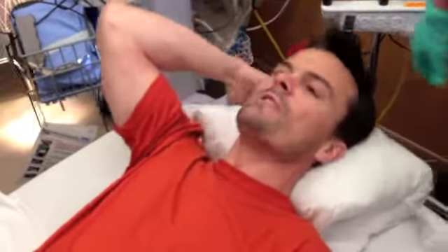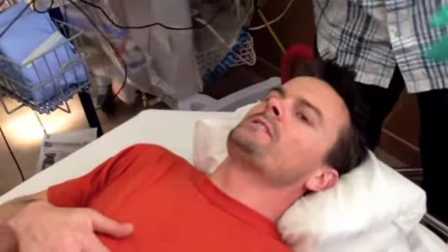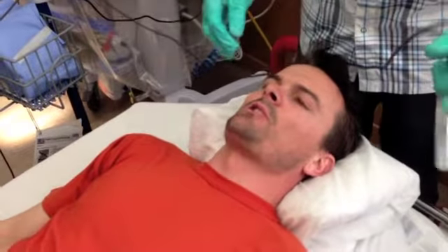The next thing we want to demonstrate is conventional direct or video laryngoscopy in a completely awake patient. This can be very useful in a patient that you do not want to paralyze until you are certain that you can access the airway, and it is remarkably easy to do. Typically you're going to use a little sedation, but you can do it completely awake. You want to protect their respiratory reflexes, and with topical anesthesia you should be able to visualize the cords at least enough to pass the bougie.